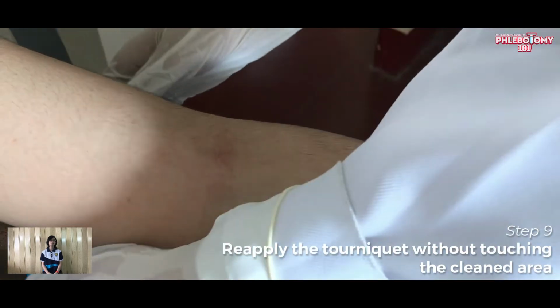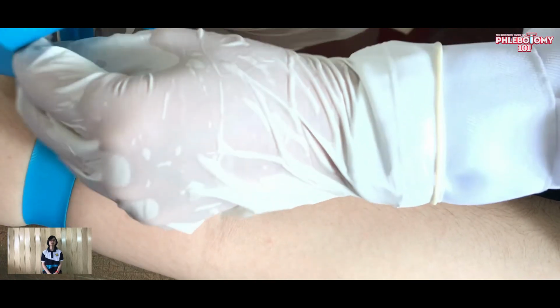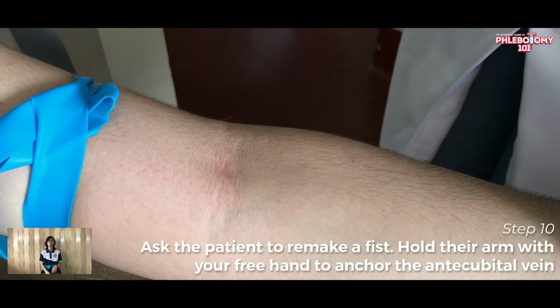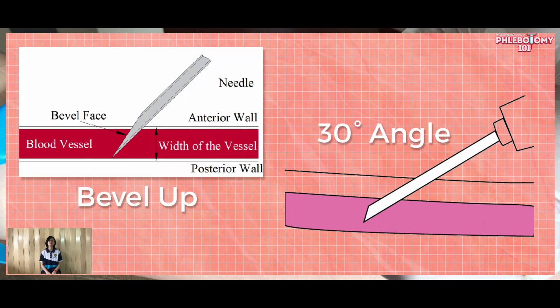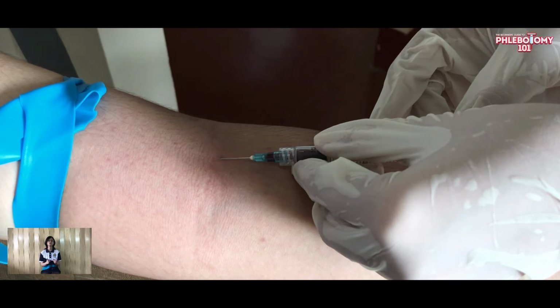Step 9. Reapply the tourniquet without touching the cleaned area. Reach for the collection equipment with your dominant hand to uncap and inspect the needle. Tandaan, kailangan sterile ang needle so it must not come into contact with anything prior to venipuncture. Replace it with a new one if it does. Step 10. Ask the patient to remake a fist and hold their arm with your free hand to anchor the antecubital vein. Then, insert the needle with the bevel facing up using a smooth forward motion in a 30-degree angle. Then, fill the syringe with the required volume.